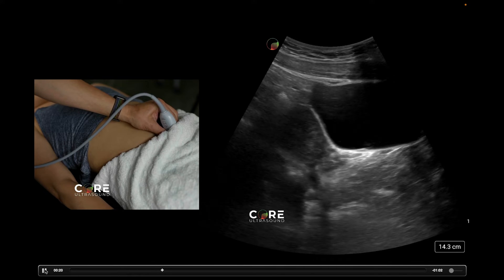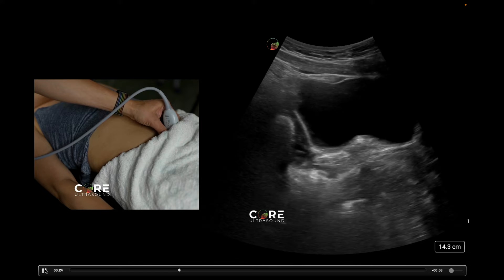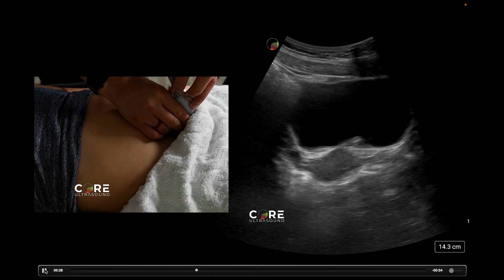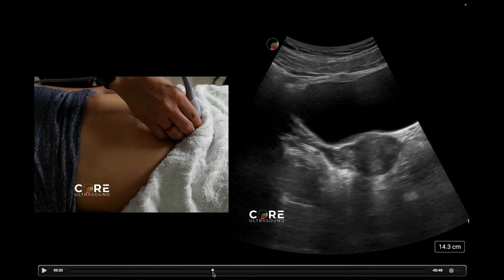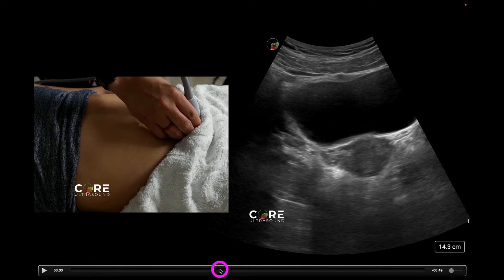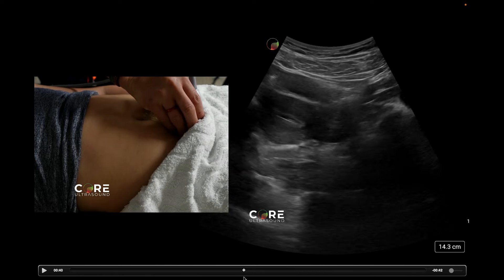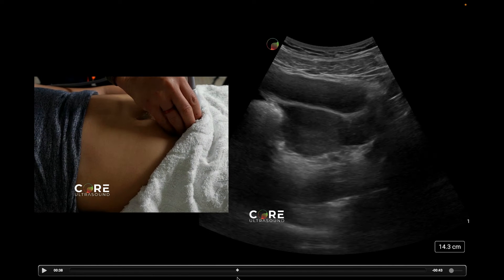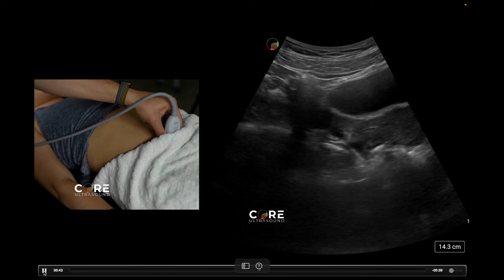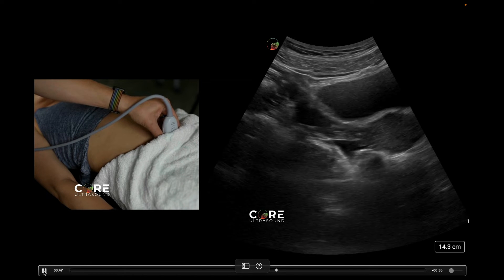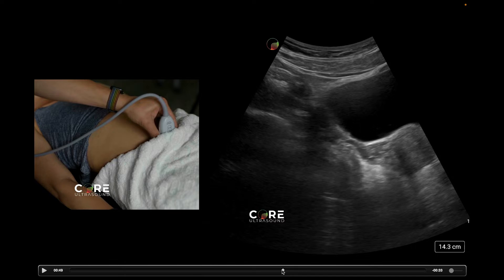Once you've identified the uterus, go ahead and fan side to side. As a point of care sonographer, it is difficult sometimes to see the ovaries, but what I do is turn the transducer into the sagittal orientation once I have the uterus well visualized and then look side to side. Right here we're actually seeing a bit of ovary, and then we are seeing another bit of ovary on this side as well. This right here is likely the adnexa on this side. It can be difficult sometimes to tell exactly what is what, especially on a non-pathologic example, but if it is pathologic, you typically can actually see the ovaries a little bit better.